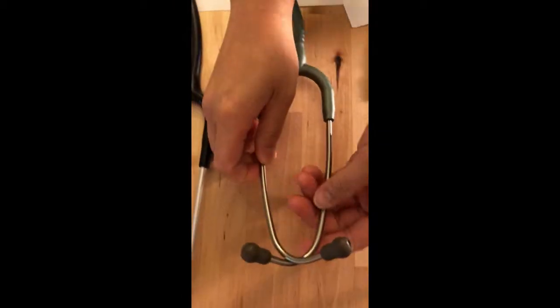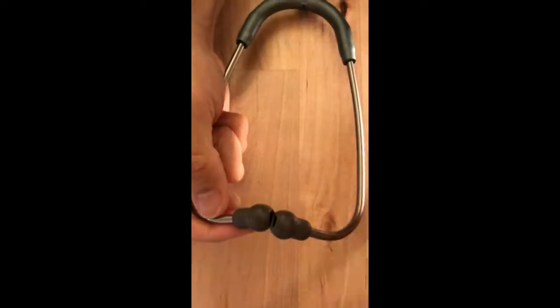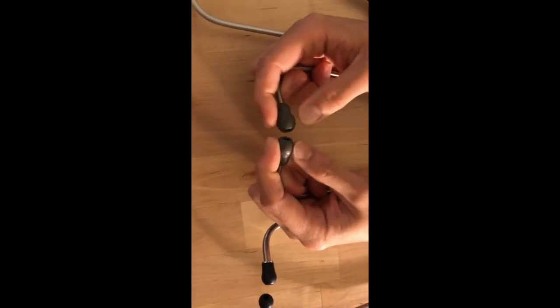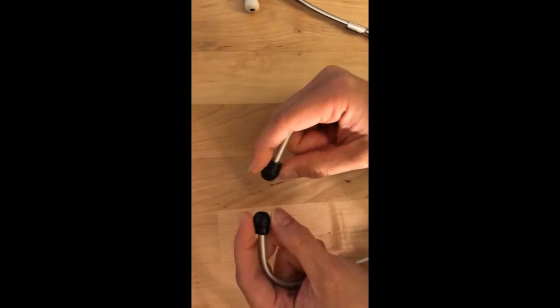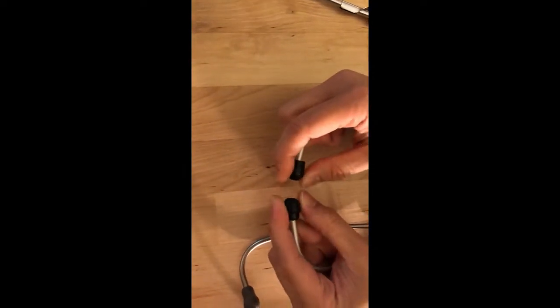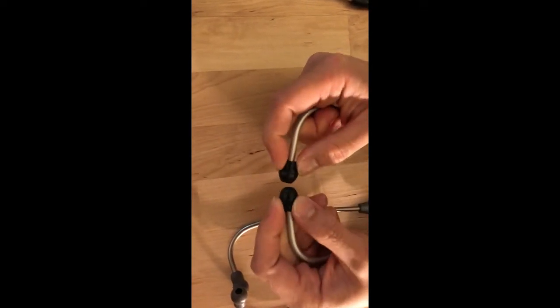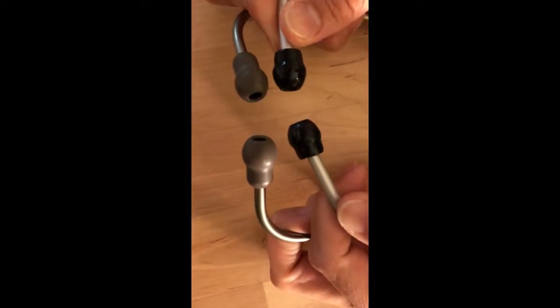Next is the Littmann Lightweight II — it's also squishy just like the Echo Core. I like the Littmann's ear tip; it fits snugly to the ears. Next is the Rely On ear tip — this is smaller and a little stiff. The only soft part is the end part; the rest is really hard and really too short compared to the Littmann and Echo Core.